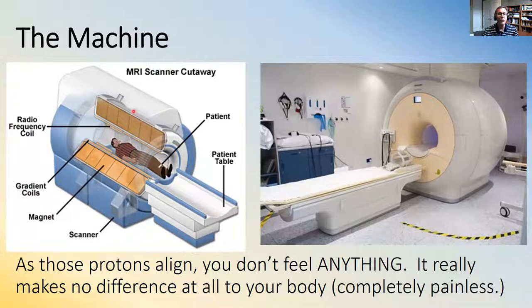And if you see a cutaway of it, it's going to look like this. So this is what an MRI machine looks like with a patient lying inside it. So if you've ever had an MRI or if you ever have to have one, this is what's going to happen. They'll put you on the table. They're going to slide you down the bore of this giant donut. And all that giant donut is doing is creating an incredibly strong magnetic field. And it is so strong that all the protons in your body are going to say, oh my gosh, I feel a magnetic field now. And they are going to line up along that field. And in this picture, the field is actually running along the bore of the magnet. So the magnetic field is probably running in this case from the patient's feet to their head. And all the protons feel that, and they're going to snap into alignment and align along that field.